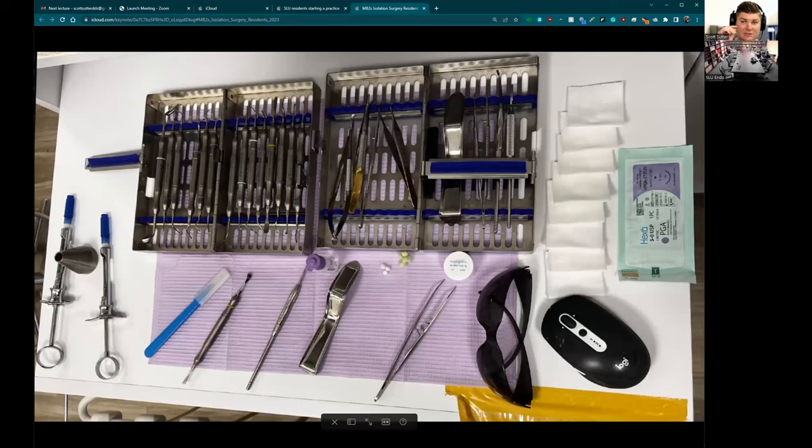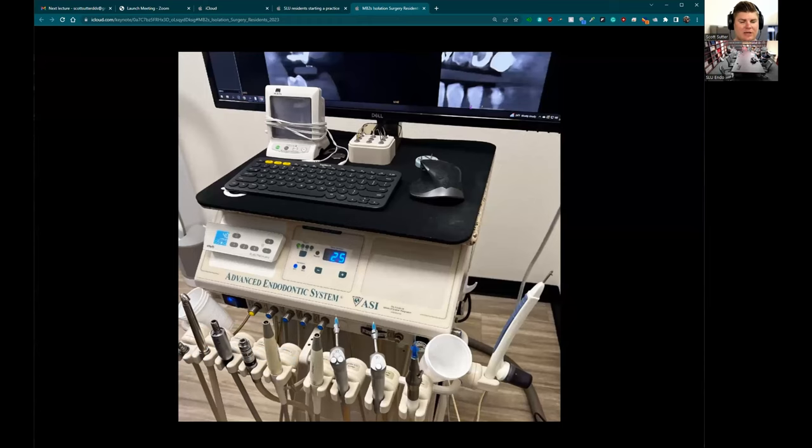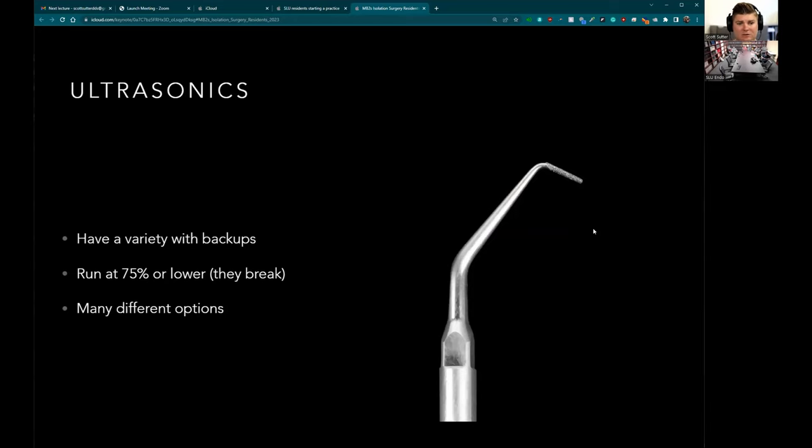This is the surgery setup — I literally just got done doing one. This is how my side looks. We have tips from a few different companies here — when you're buying your own stuff let me know and I'll give advice on which ones I like. The only setup you need is the air impact 45 on the actual handpiece. I like having two ultrasonics because I use multiple ultrasonic tips for surgery, and you want to run them usually at 75% or lower.